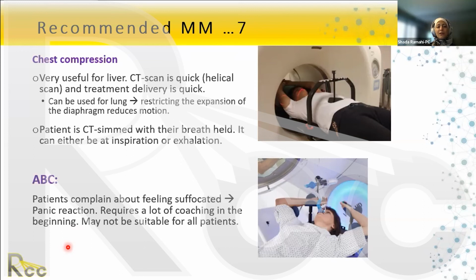Definitely, if you want to go with the ABC solution, you have to sit down with the patient, coach them, train them, and tell them what to expect. Because if you hook up the patient directly with the device, of course they're going to panic. So maybe you can have a dry run during CT SIM, or even in the clinic, if you have an educator nurse or a nurse coordinator. You can book time in the clinic, get the device, and have the patient feel how it feels to be connected to this device, so the first time they experience it is not on the CT SIM couch.